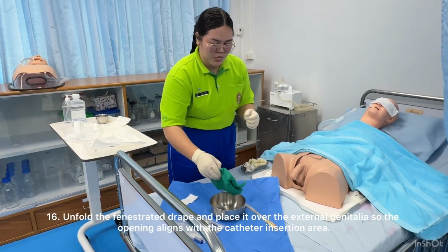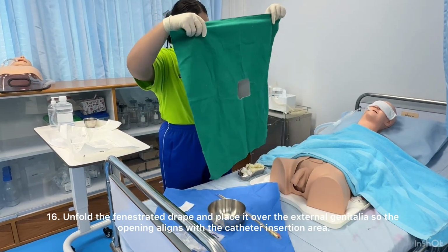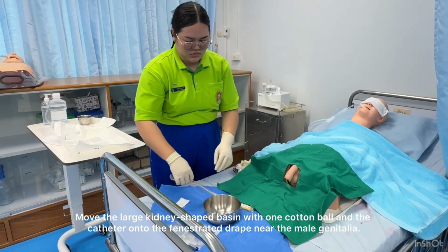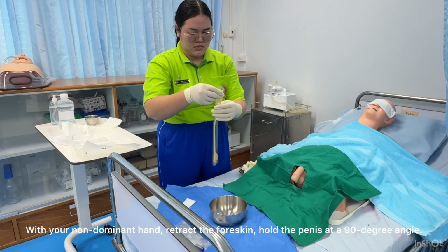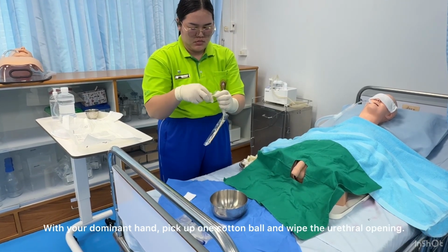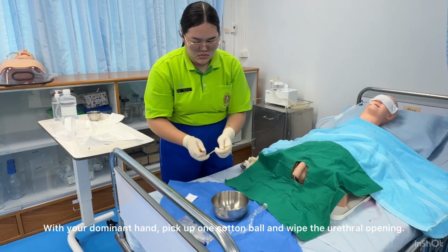16. Unfold the fenestrated drape and place it over the external genitalia so the opening aligns with the catheter insertion area. Move the large kidney-shaped basin with one cotton ball and the catheter onto the fenestrated drape near the male genitalia. With your non-dominant hand, retract the foreskin. Hold the penis at a 90-degree angle. With your dominant hand, pick up one cotton ball and wipe the urethral opening.